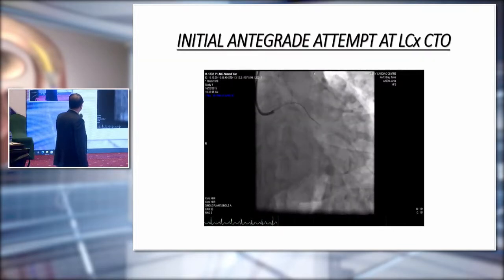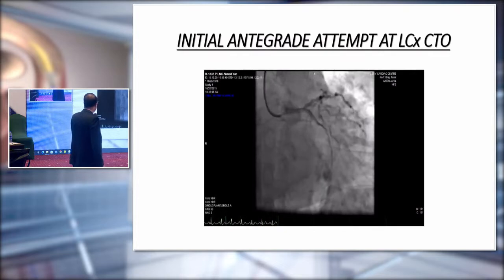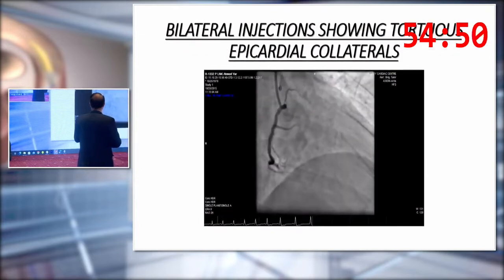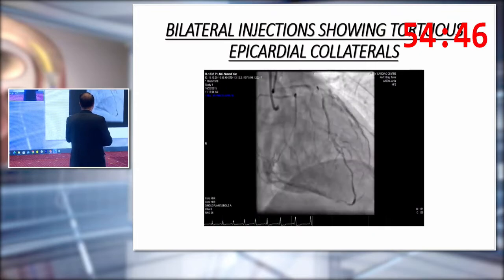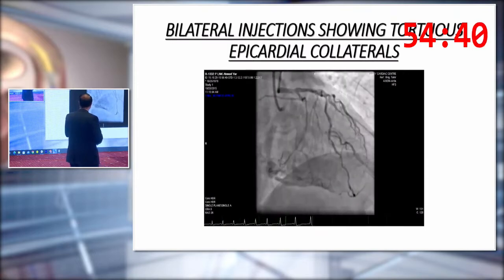So this was a circumflex CTO, which was initially attempted antigradely, but the wire went subintimal. Although the ideal approach would have been to do an antigrade dissection re-entry, we don't have that facility available with us. So we had the option of retrograde, and we decided to go retrograde on this case.